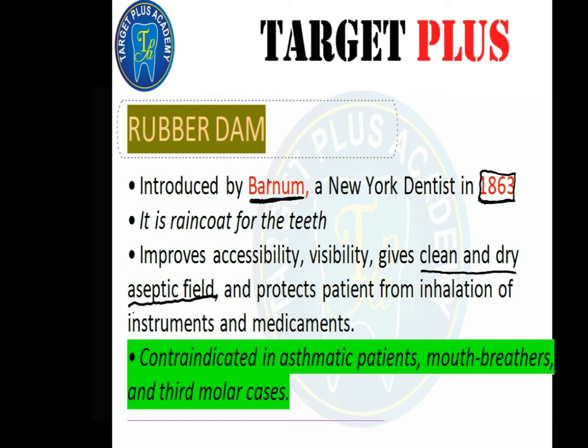Now another MCQ that can be asked is that it is contraindicated in asthmatic patients, mouth breathers and third molar cases. So important for your entrance exam, it is contraindicated in asthmatic patients, mouth breathers and third molar cases.